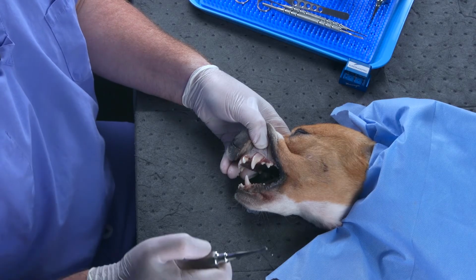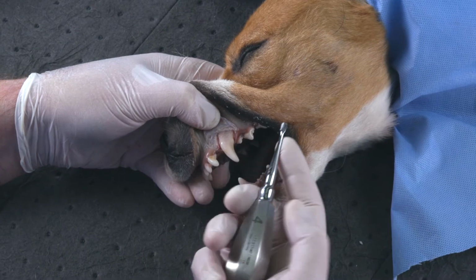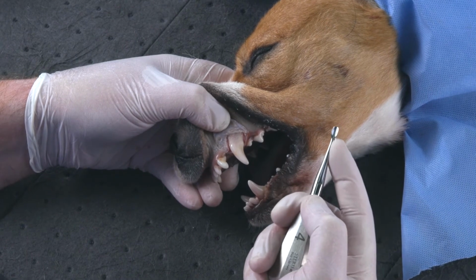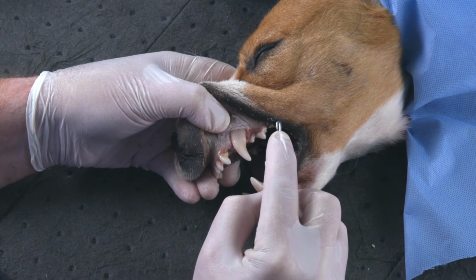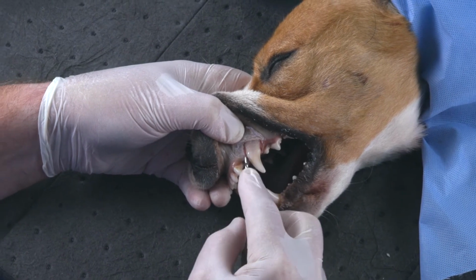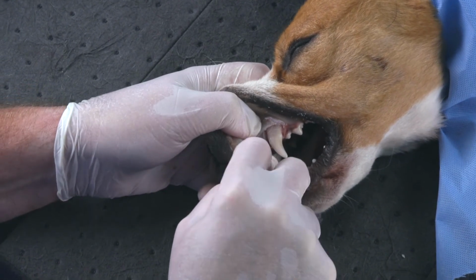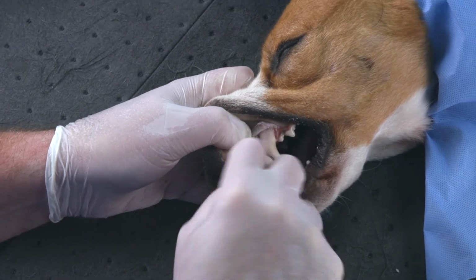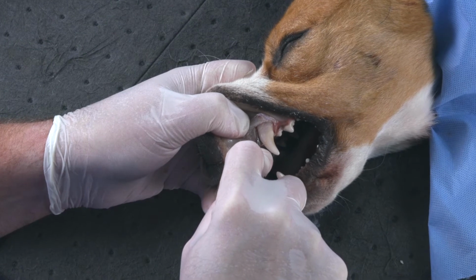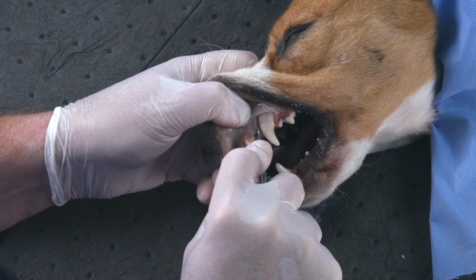After the bone removal with a good high-speed drill, now I'm going to use the number 4 winged elevator with the bulb held in the palm of my hand, grasped firmly with my finger close to the cutting blade. This blade has been freshly sharpened, and now I can insert the instrument between the root and the bone, pushing in, oscillating as I go to get this elevator as far down between the root and the bone as I can get it, and then beginning by applying some gentle, steady twisting and holding to the root.